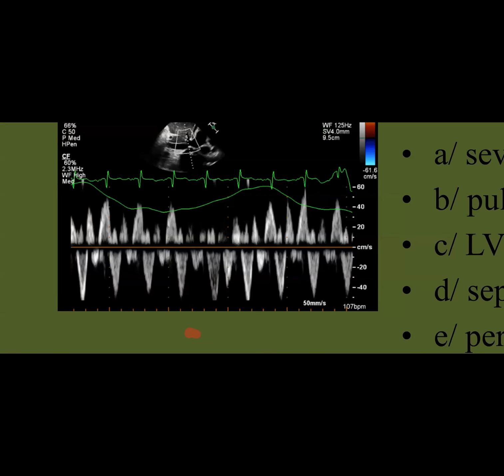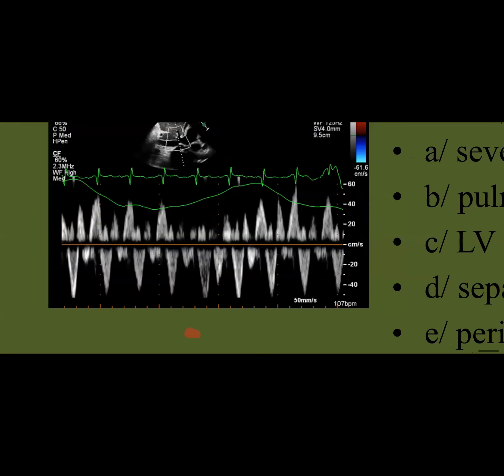Exactly. Yes, the forward flow decreases. This part is inspiration. Look at the inspiration flow: slow, right? Look at the expiration, this part, and this is the flow. So the flow increases in expiration. What's that? Constriction. Yes, this is constriction. Very good.